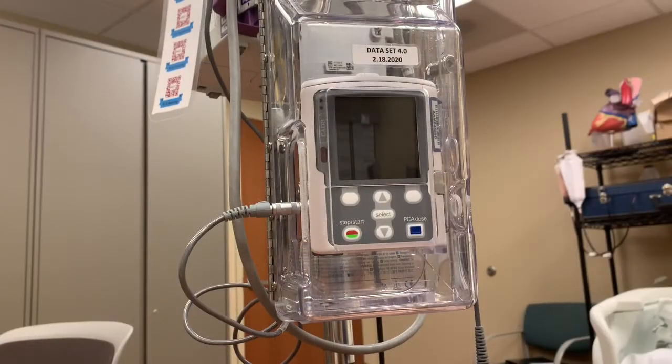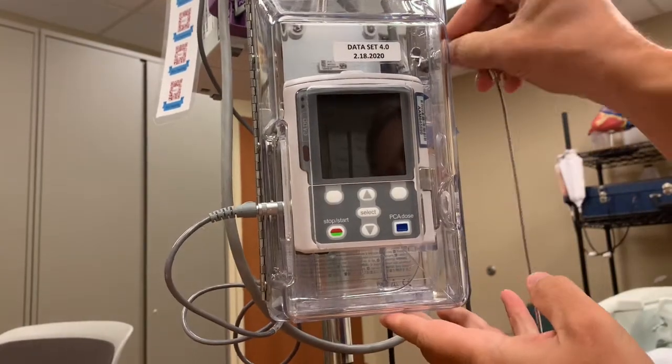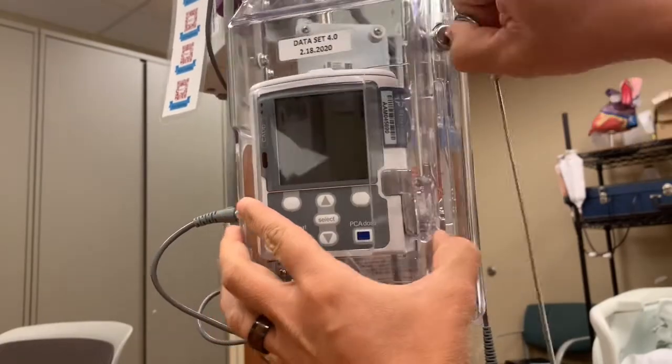You probably noticed that the CADD pump does not have a power cord. That's because it runs off of batteries. If you need to replace the batteries, you'll first need to obtain the PCA key. You can get this from the shift administrator in the basement. Use the key to unlock the door and open it.